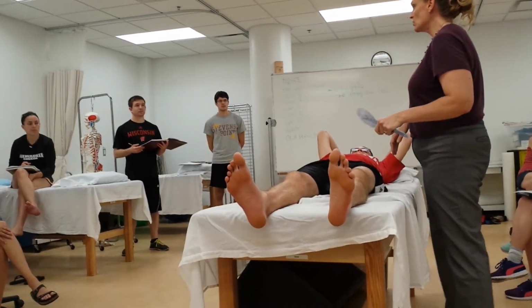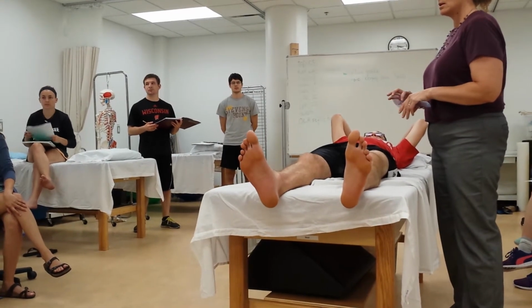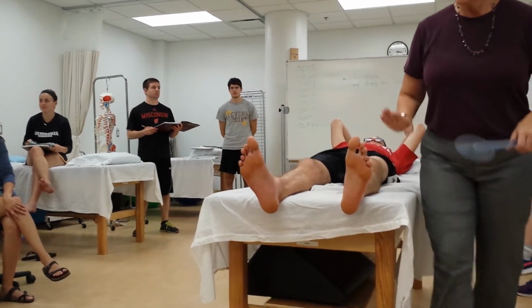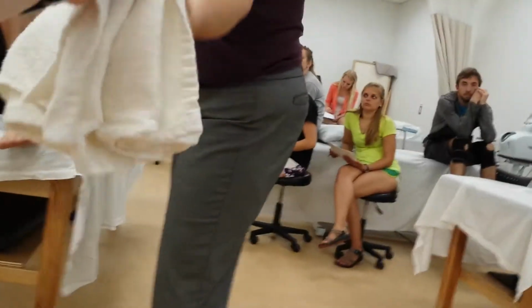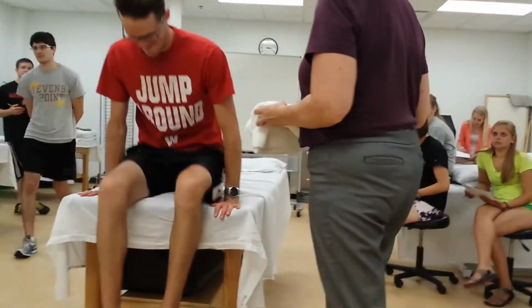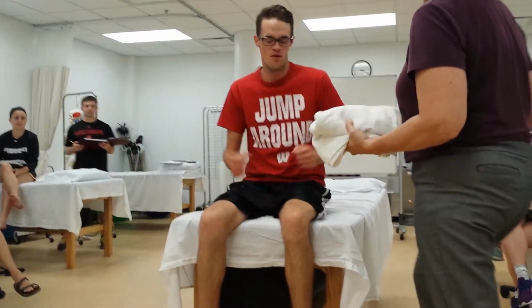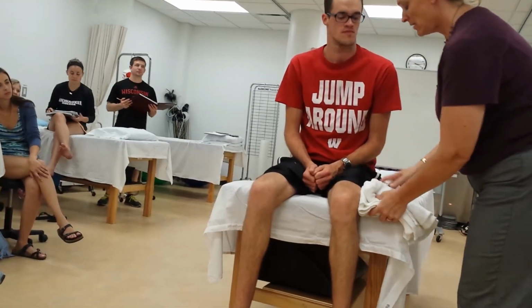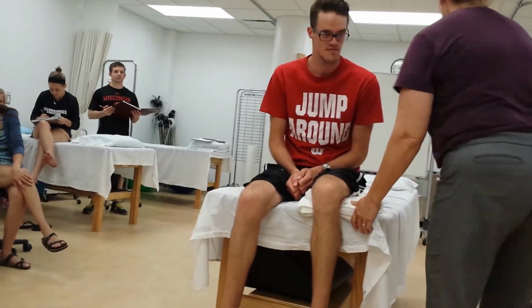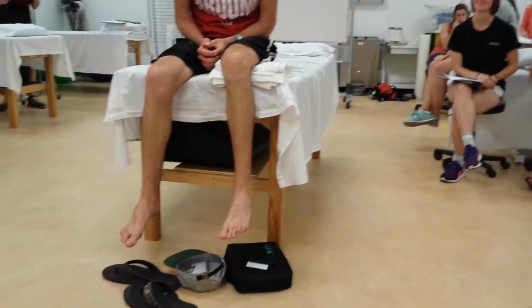I'd like to go ahead and show you medial and lateral rotation, or would you like me to stop? Keep rolling. Okay. For this one, I need you to sit on the side for me. Are you expecting me to not be normal? I was, actually. Thank you for proving me wrong. Do I get a stool? No. Go ahead and lift this leg up. You want the leg to be dangling. It's okay, everyone. We'll give him a stool on the other side.